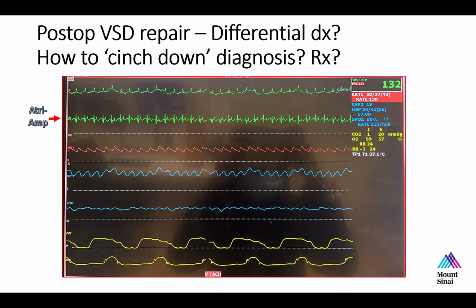And so you always want to get that 12 lead ECG reasonably early after arrival, because usually the patient is in an atrial-based rhythm, whether it's A-pacing or sinus rhythm. And that may prove to be a very important document when you are assessing the patient later if things were to change in the rhythm, okay?